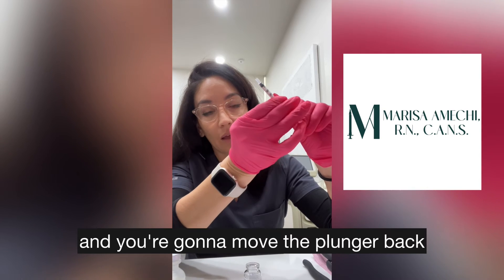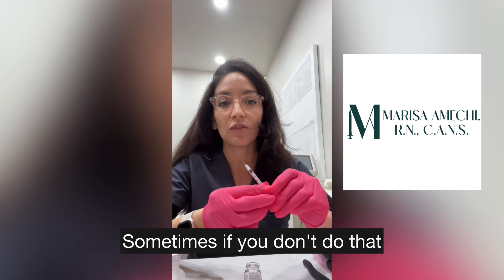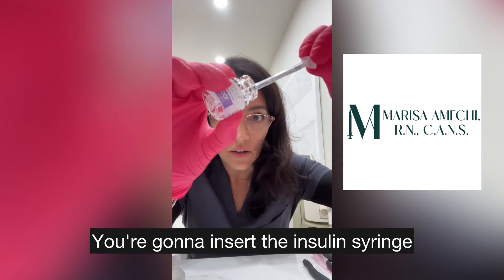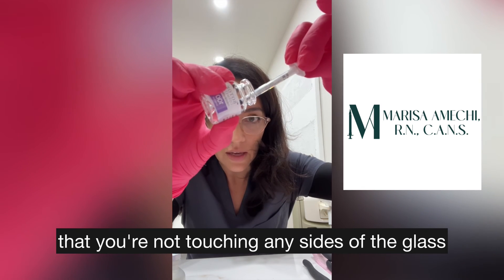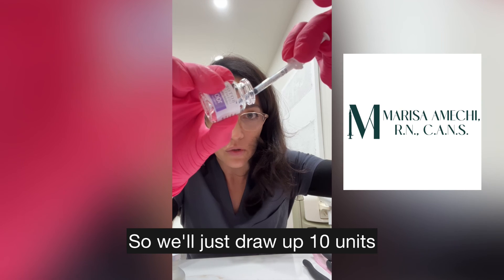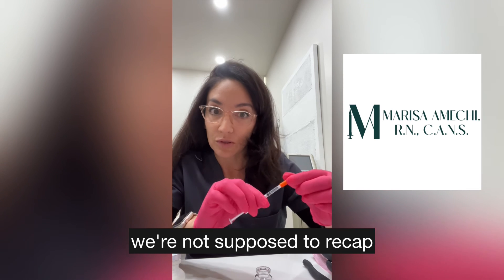Then I'm going to use an insulin syringe — I like the Easy Touch insulin syringes, this is a 31-gauge 5/16ths. Remove the cap, prime it, and move the plunger back and forth to make sure it's gliding smoothly, because sometimes it gets a little stuck. With your mixed vial, make sure you can see the water line, insert the insulin syringe making sure you're not touching any sides of the glass, and slowly pull back on your plunger to however many units you need. We'll draw up 10 units — just making sure there are no air bubbles.